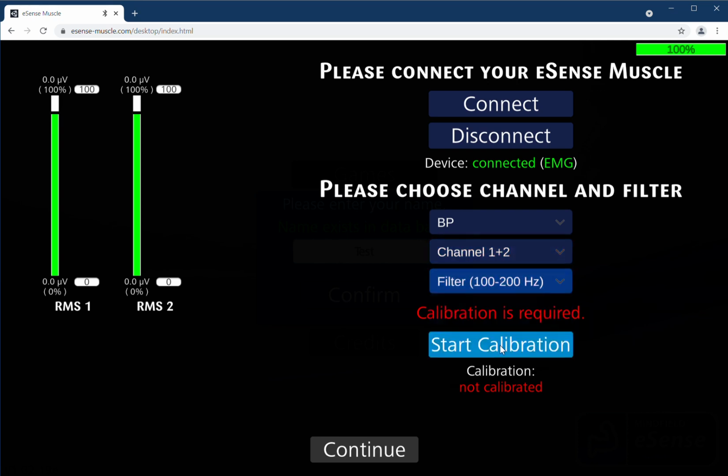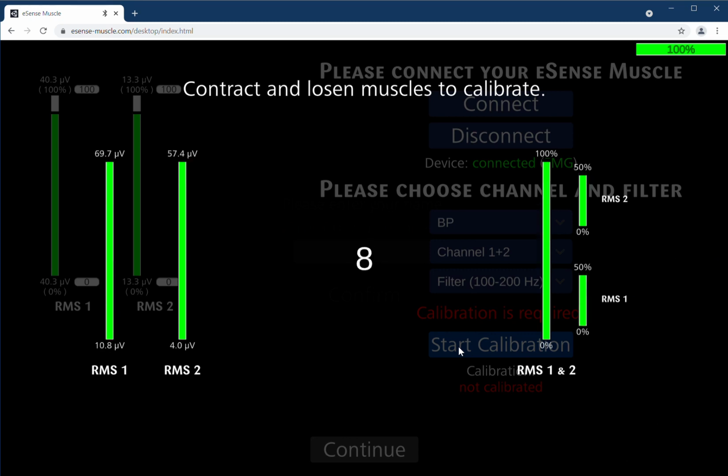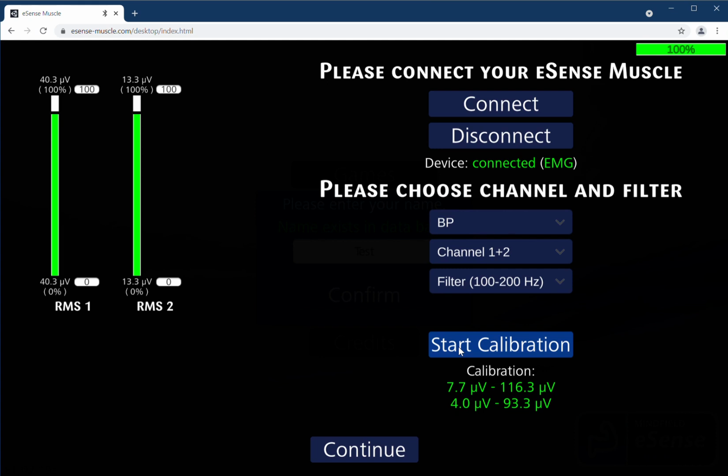Okay, so now I click Start Calibration. So now I need to contract and loosen my muscles to calibrate. That means I have 10 seconds and I do a couple of contractions, and then the eSense muscle is calibrated. You see the lower threshold here is 7.7 for channel 1 and the upper 116, and 4.0 for channel 2 and 93.